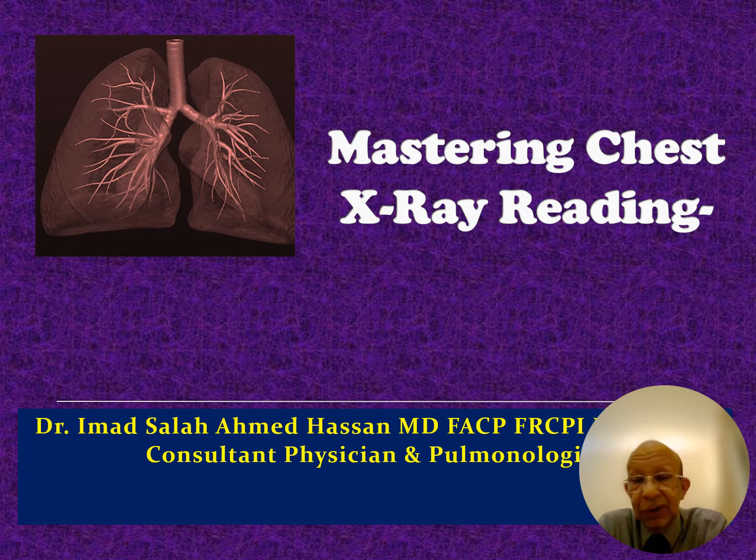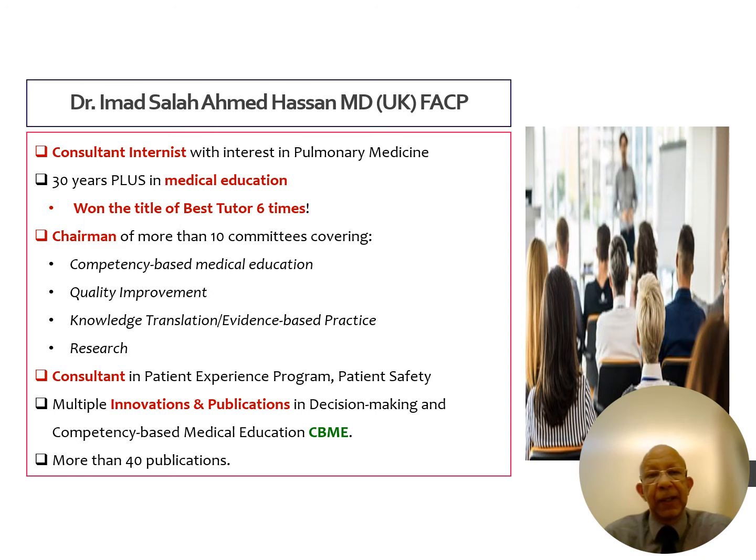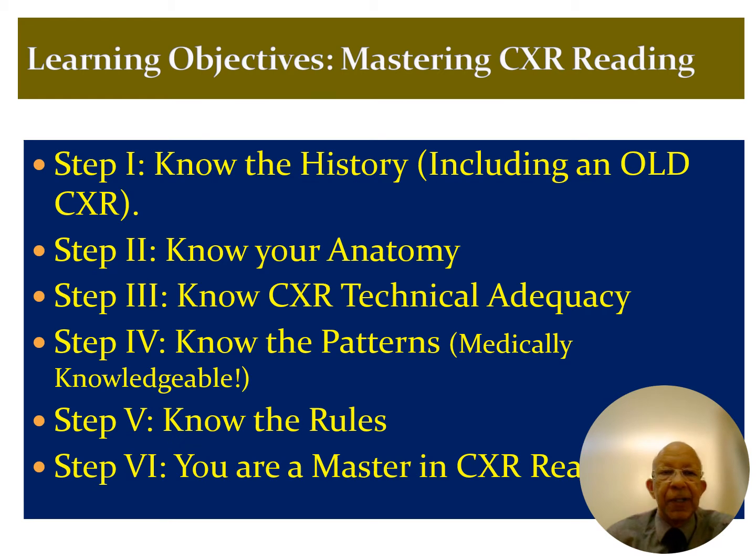It's a presentation that will empower you with simple tools and rules to smartly read and confidently interpret chest X-ray abnormalities. For those who do not know me, I'm a primarily consulting internist with interest in pulmonary medicine. And I've actually been involved in competency-based medical education and training for more than 20 years.